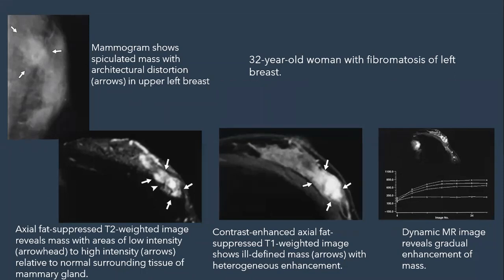Yeah, it represents only 4% of the extra-abdominal, but within the breast tumors, it represents 0.2% only. It's extremely rare, but it has a rare association with implants, silicone implants. It occurs rarely with a silicone implant. Okay.